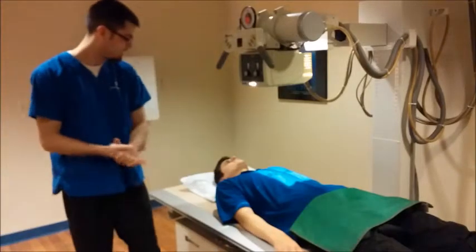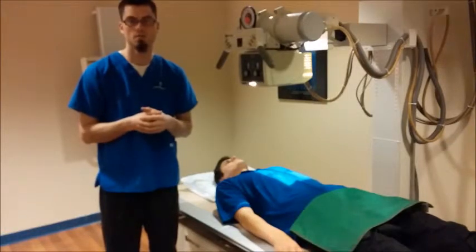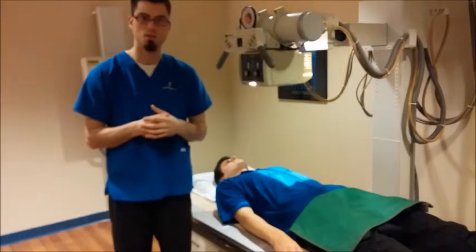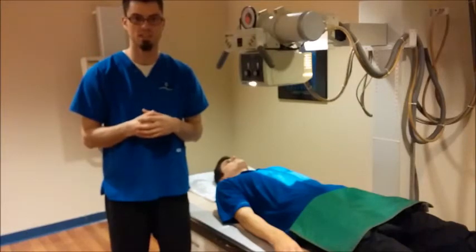All right. And for this exam, we want to use small focal spot again for showing bony detail, and also center chamber of the AEC, and we'll also want to expose this one on suspended expiration.